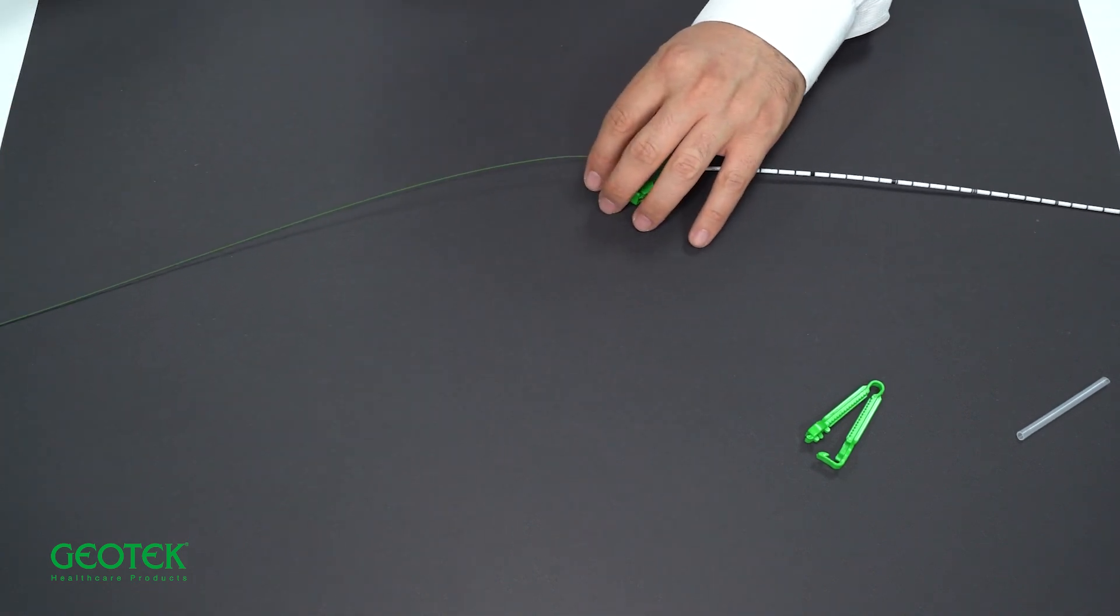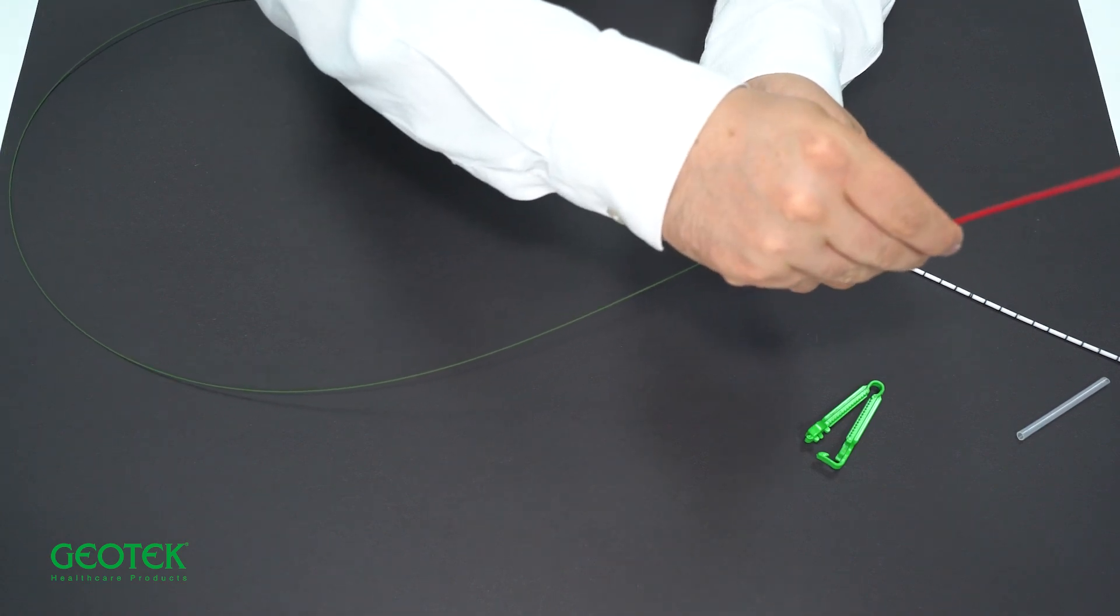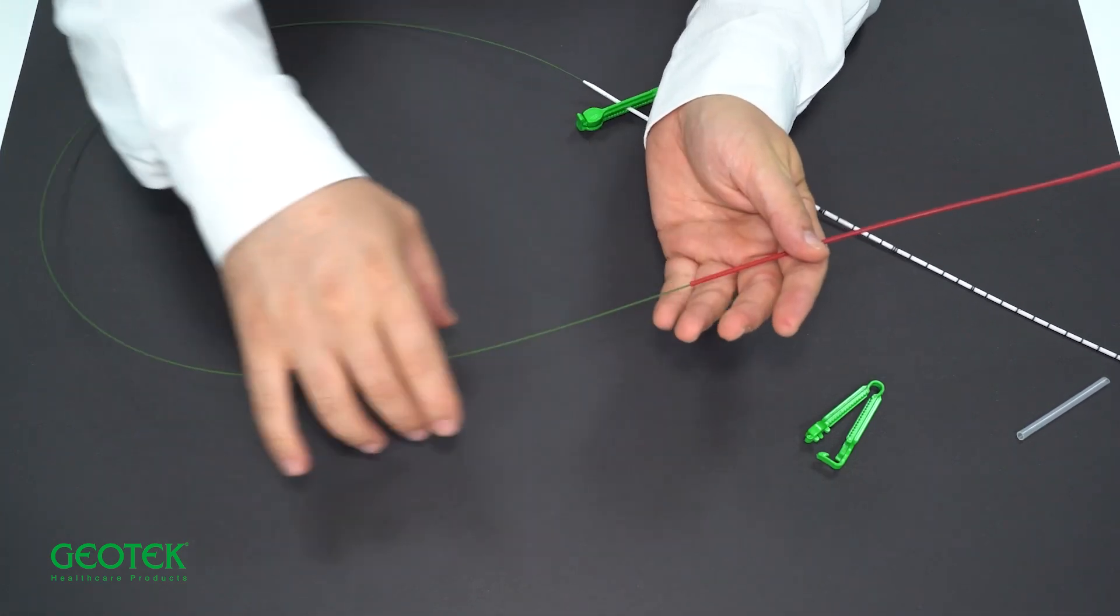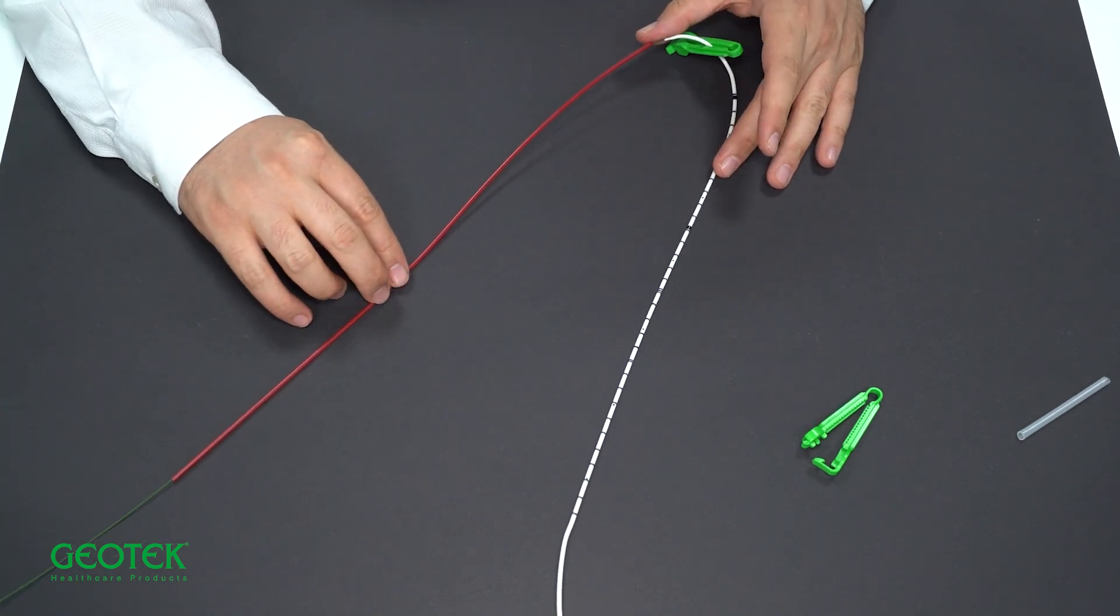In order to advance it through the cystoscope or ureteroscope, we place our pusher on the other side of our stent, that is, on the free side. In this way, it can be advanced through our cystoscope.